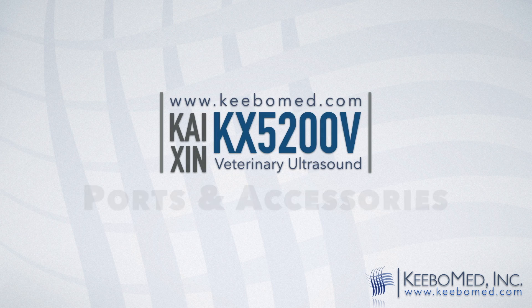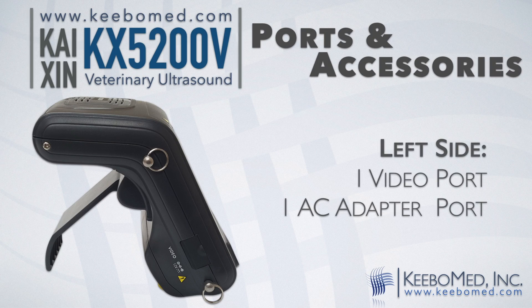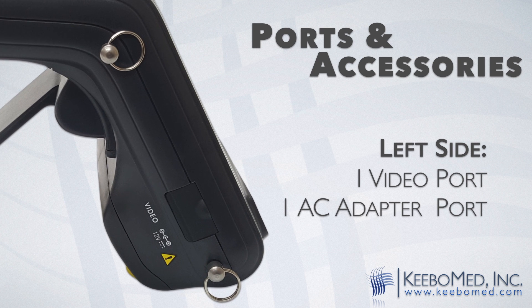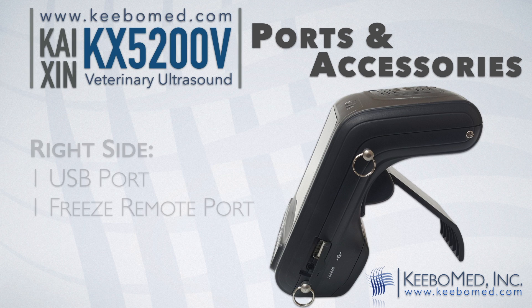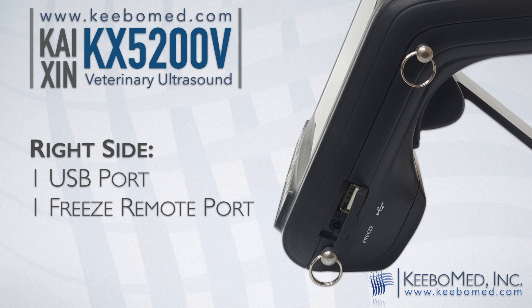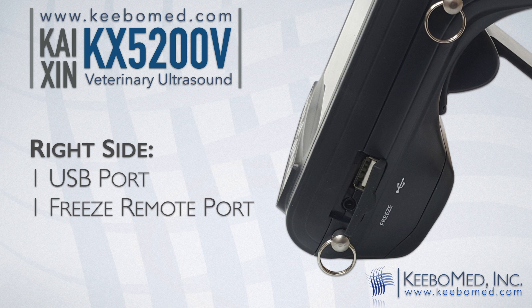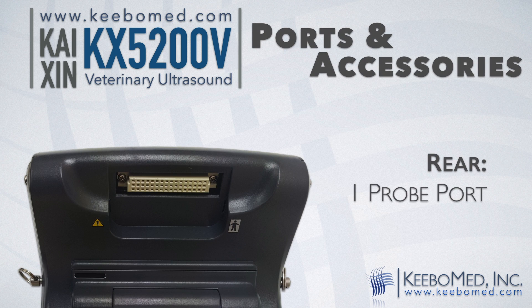Here's a closer look at the connectivity ports on the KX5200V. The left side features one video port and one AC adapter port. The right side includes one USB port and one image freeze remote port. The rear features one probe port.